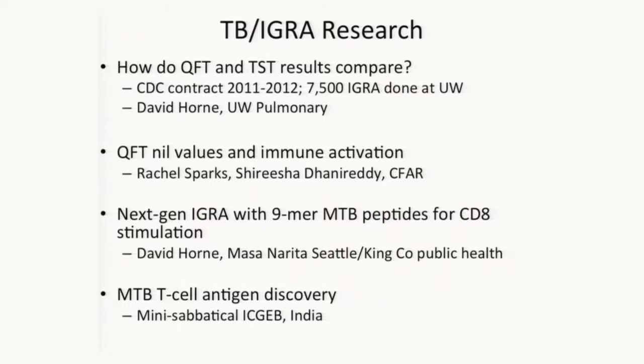We do have a research arm too, and I'm just going to mention these themes and show one slide, and that's it. Really, the bulk of the talk today is going to be about the clinical test and the experience with the clinical test. This test is a candidate test to replace or augment the tuberculin skin test. We think of the PPD, the Mantoux test, it's got a bunch of names, TST, tuberculosis skin test.